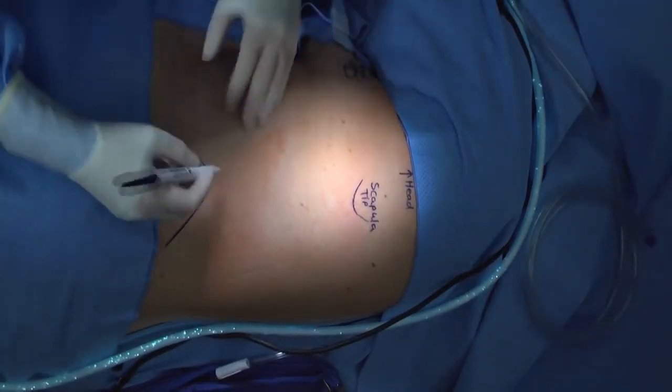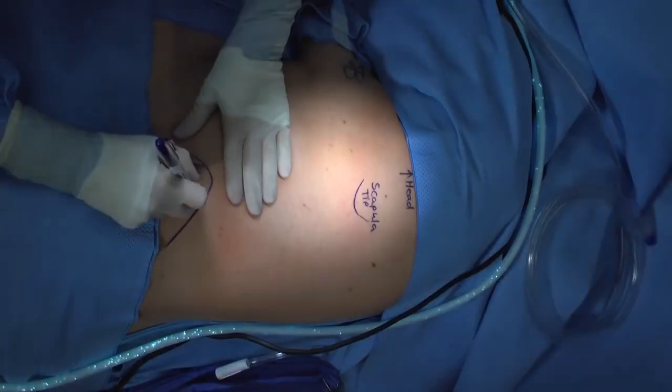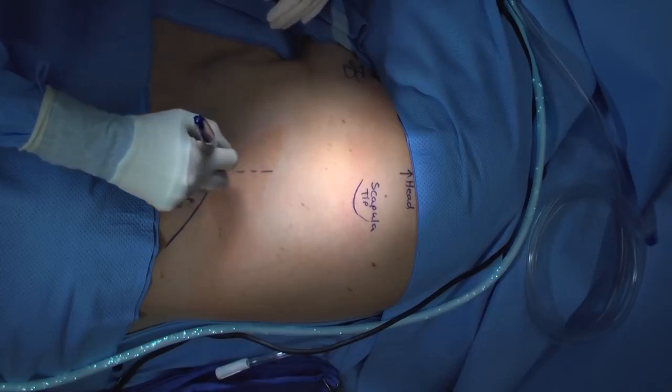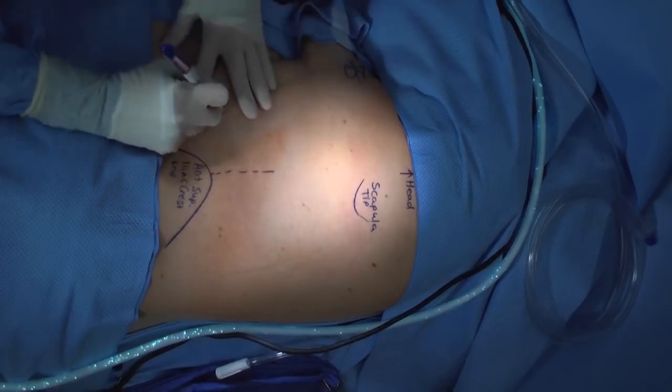We start by identifying the tip of the scapula. This can be accomplished by pushing down on the shoulder to gently move the scapula against your finger. Mark that spot. Next, feel for the anterior superior iliac spine. Between these 2 points is going to help you to identify your mid-axillary line.